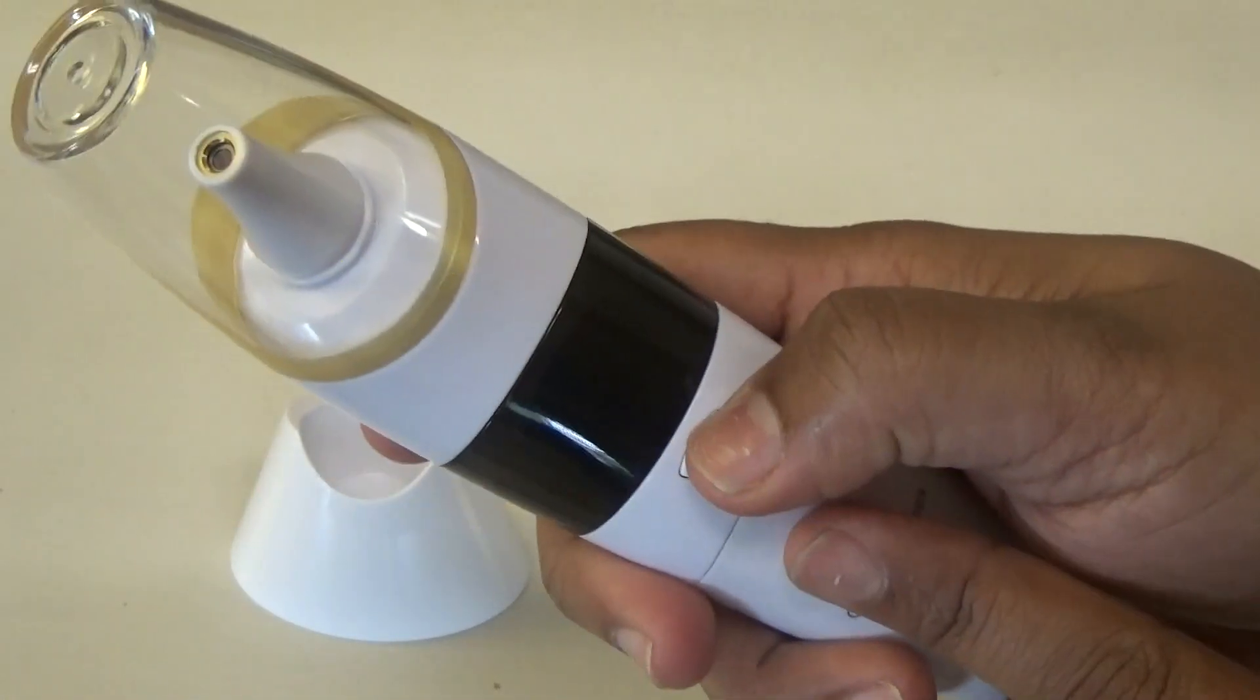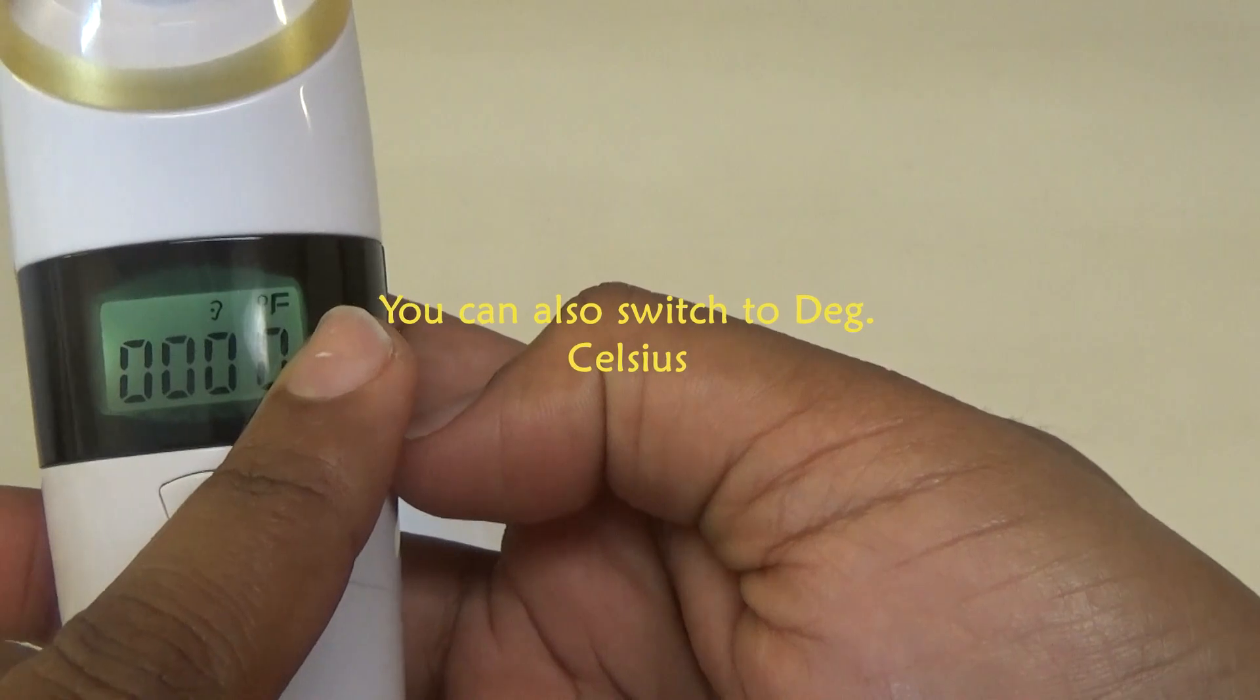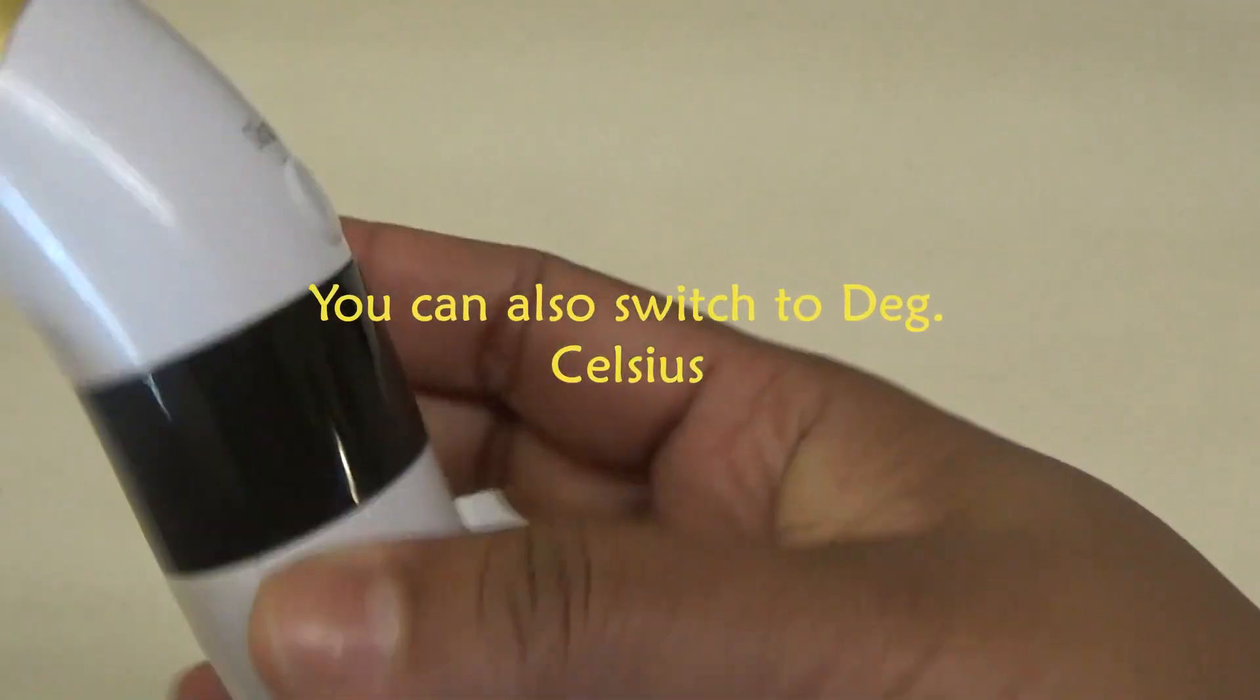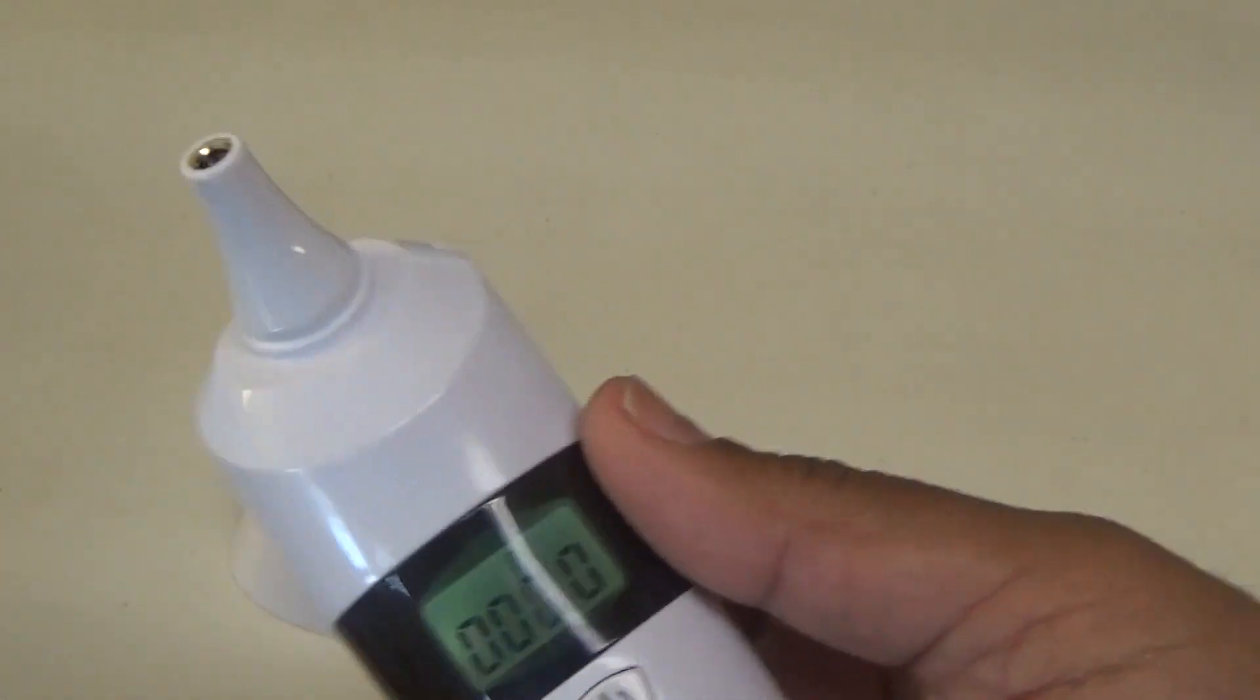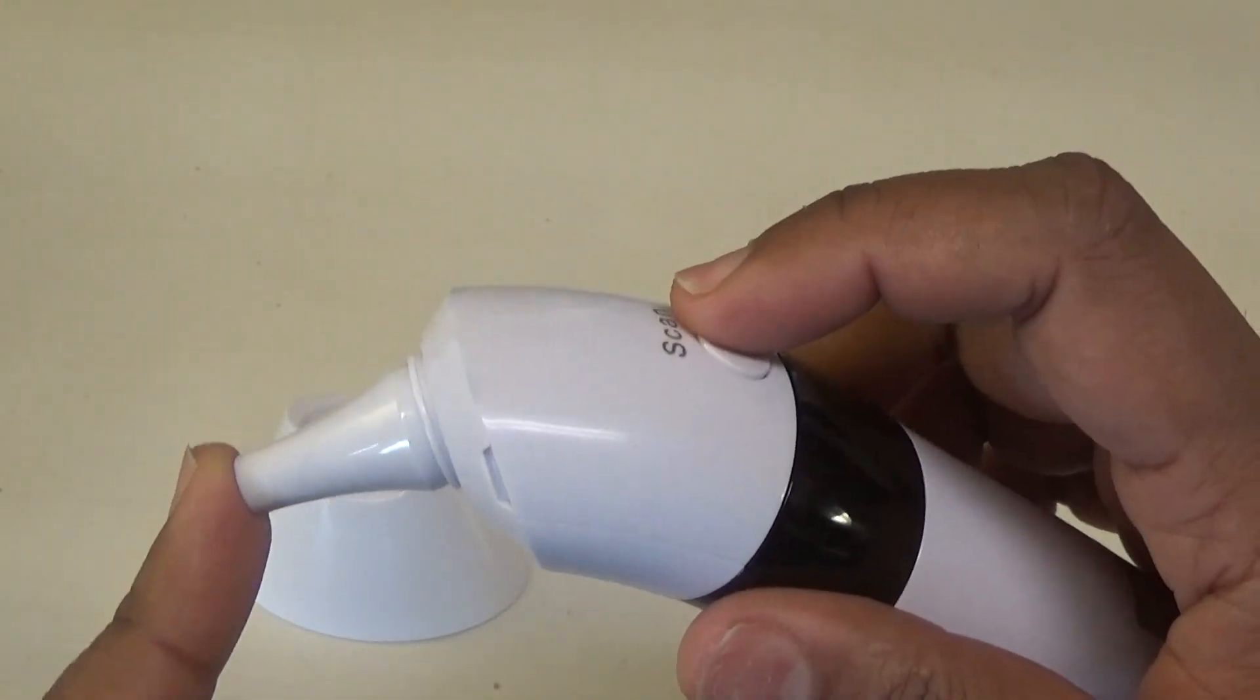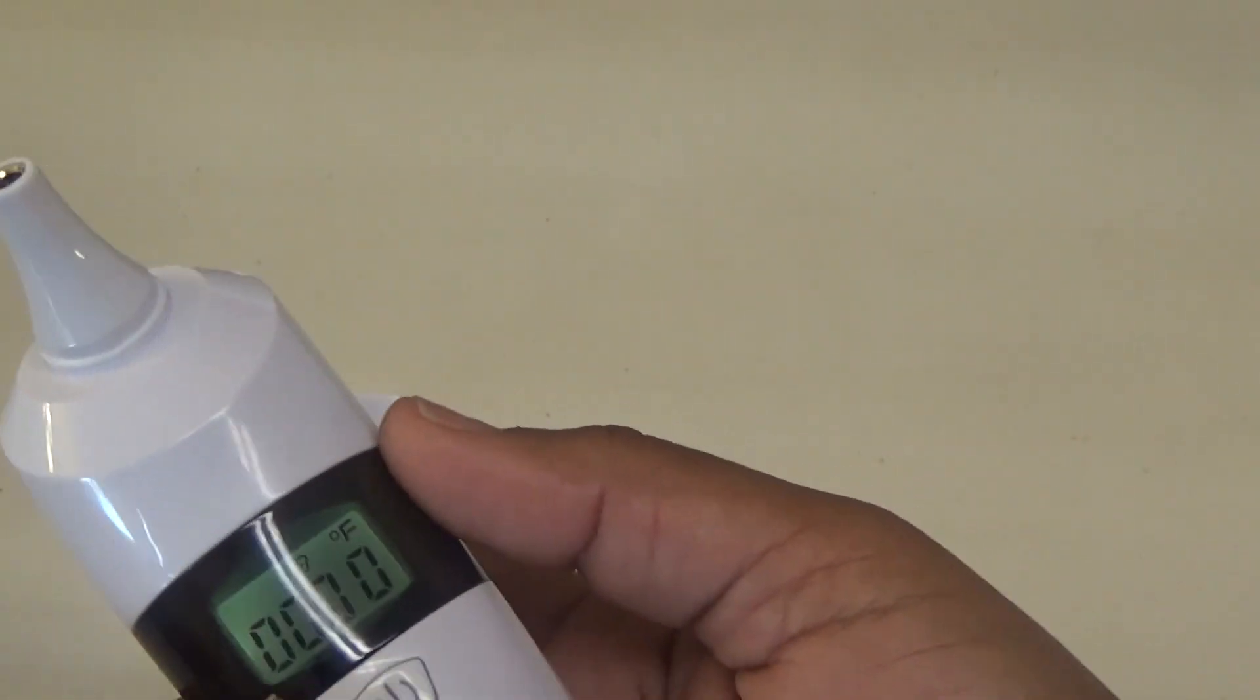This is your power button and right now it's in degrees Fahrenheit. All you have to do is remove this cover and you would put this part into your ear and then press scan. So I'm going to try it and I'll show you.